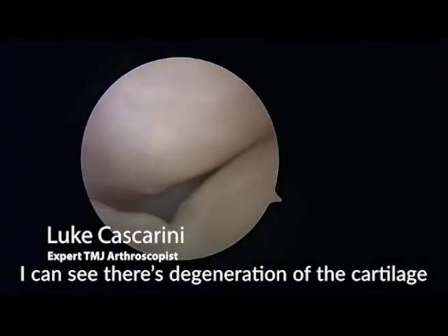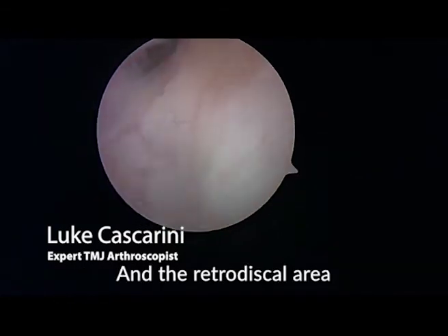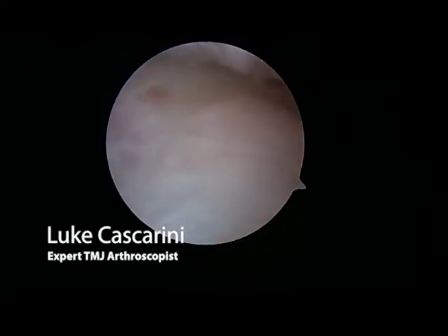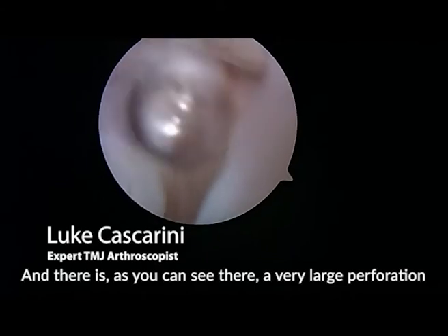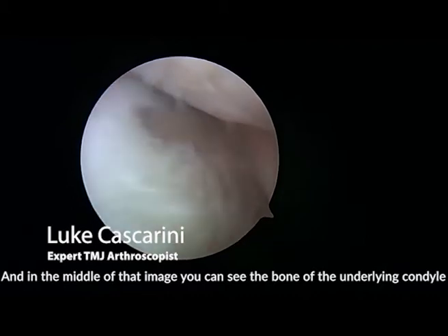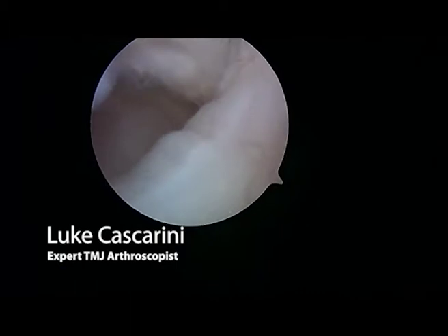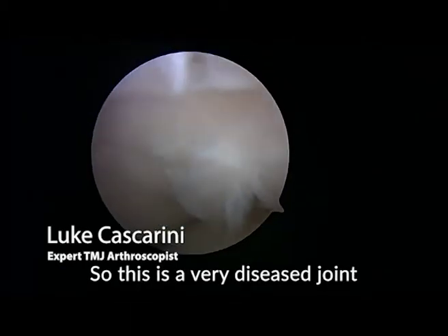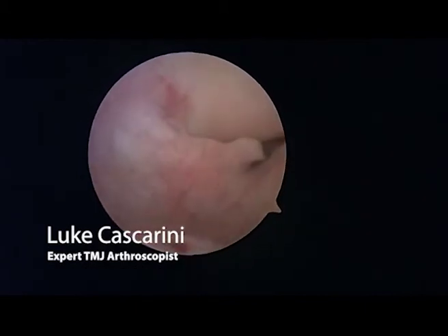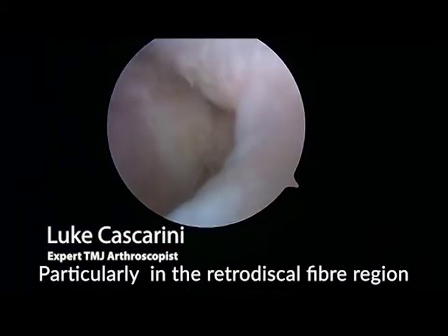I can see there's degeneration of the cartilage and inflammation of the synovium in the retrodiscal area. There is a large perforation through the disc, and in the middle of the image you can see the bone of the underlying condyle moving there — that cartilage is damaged as well. So this is a very diseased joint with disc perforation, significant degeneration, and inflammation particularly in the retrodiscal fibres region.